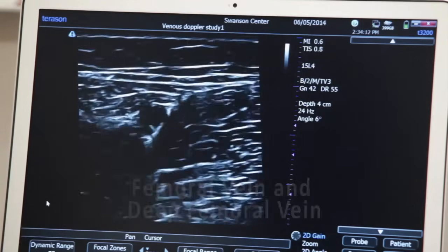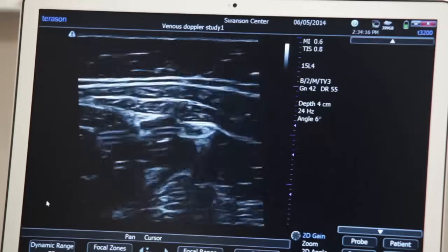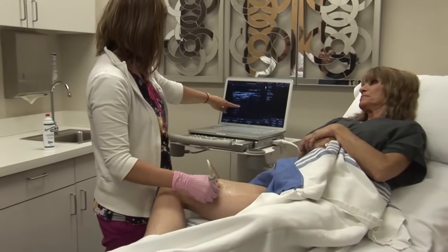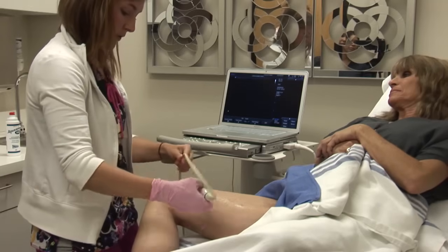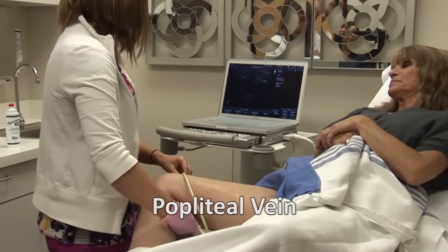We follow the femoral vein down the thigh distally, pressing as we go along to show that there is no thrombus in the vein. And then we will move to the popliteal vein behind the knee.